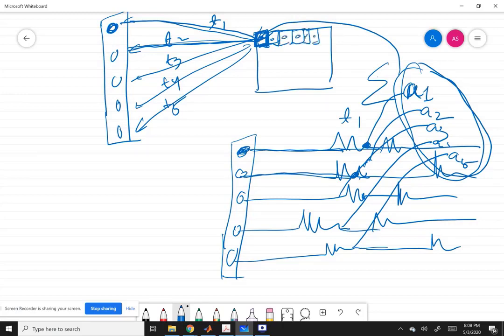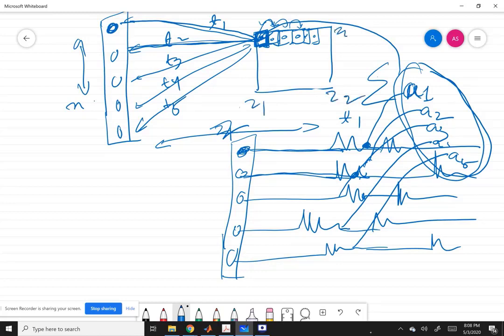You repeat it for every pixel in the zone in which you want to do the reconstruction. You can choose the granularity, like the pixel distance between each pixel, in millimeters. This dimension is typically called the z dimension, so z1 to z2, and this dimension we are calling the x dimension, x1 to x2, with a granularity which you can choose, like how many millimeters difference there are between the pixels.